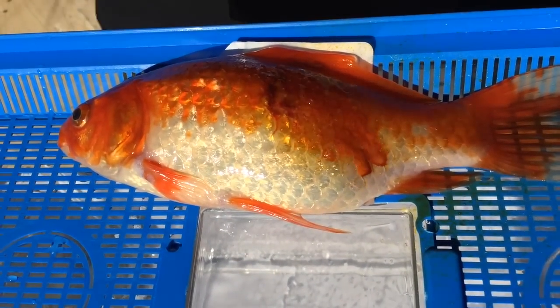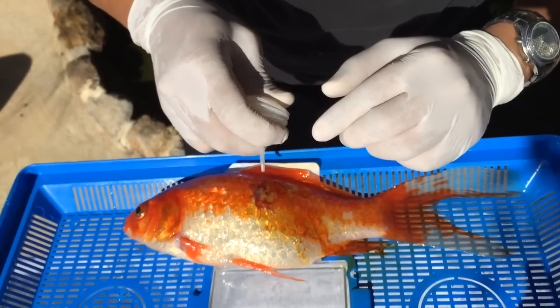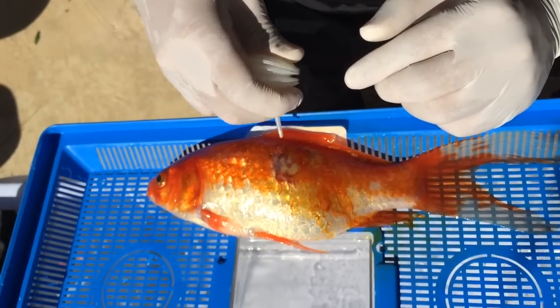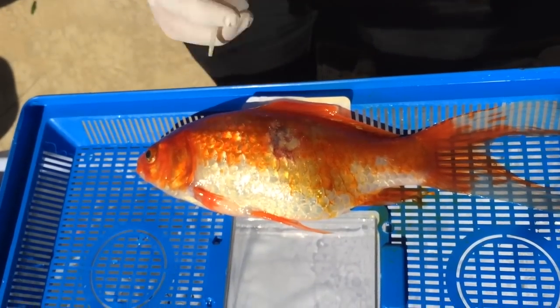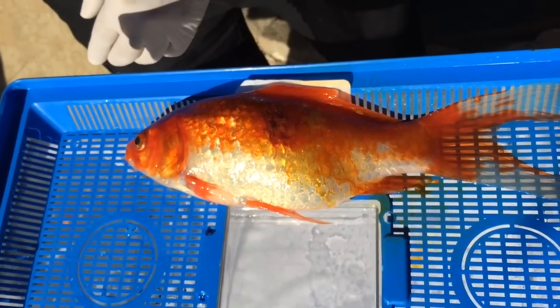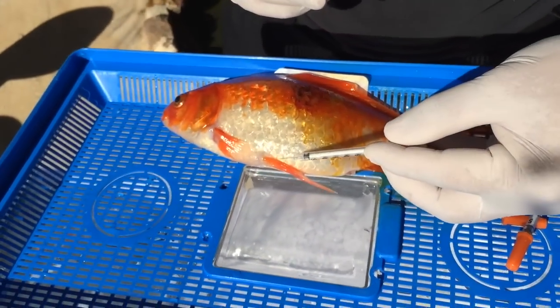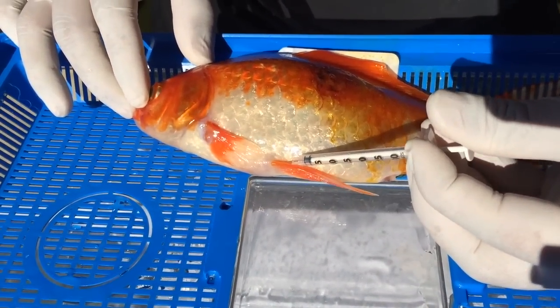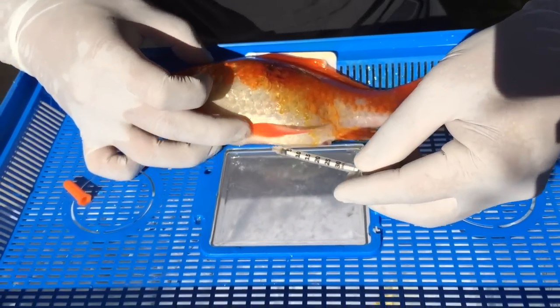Okay, so now we've cauterized the edges of the tumor. We're just going to apply some betadine and then apply the powder gel — the fish bandage — in thin layers to hold the betadine in place. And just before recovery, we're going to give him some anti-inflammatories, injecting into the muscle at the base of the pelvic fin, and some antibiotics — this is oxytetracycline. He's just about to wake up now.